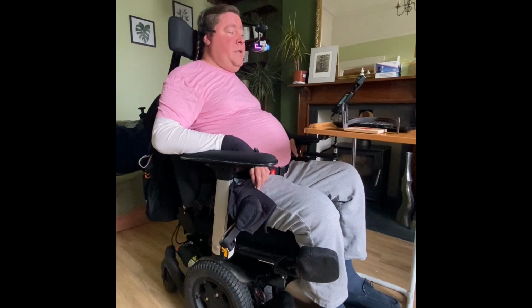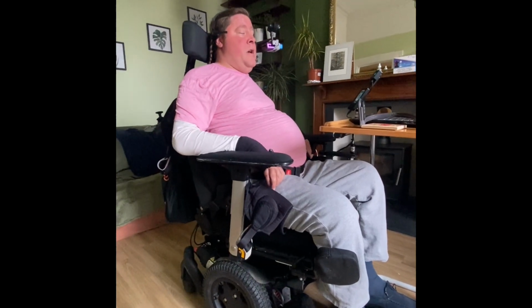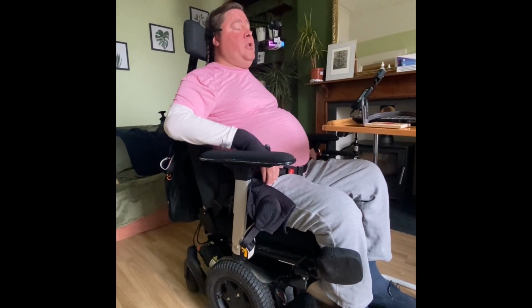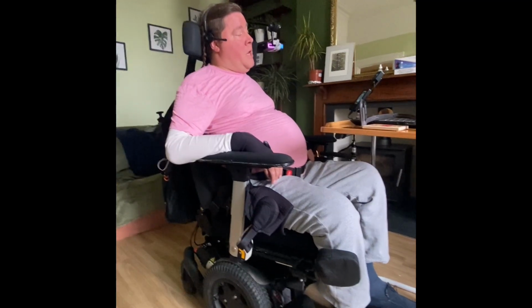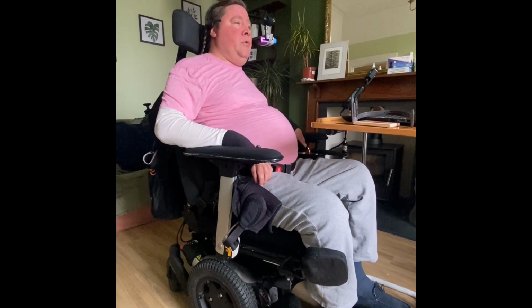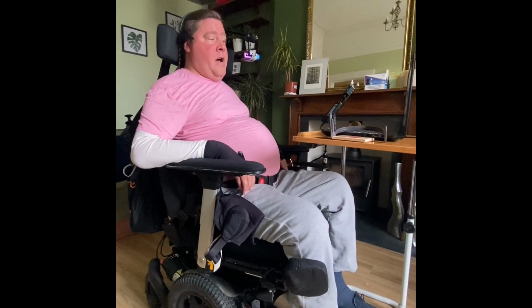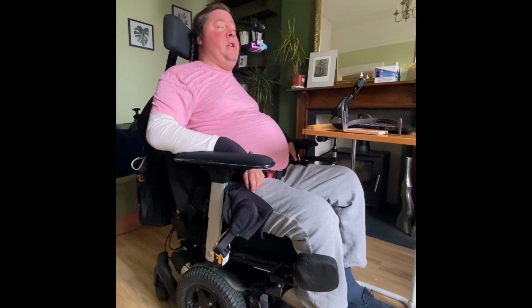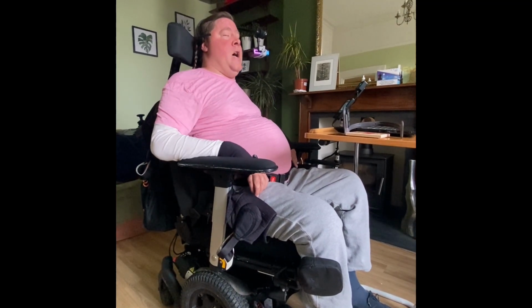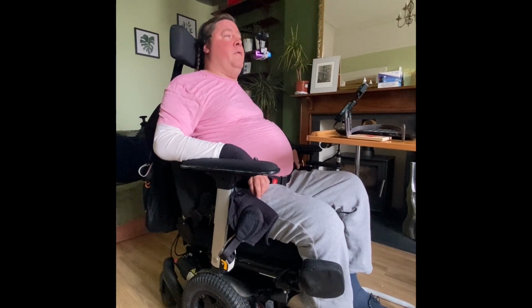The second part of this is a bridge which allows that graphical user interface and the inputs that are given by the quadriplegic user, to translate into actual hardware manipulation of motors and various sensors, allowing the quadriplegic to drive using either head movements or voice control. Finally, I have done a simulation in Unity of a flying wheelchair algorithm that would allow a quadriplegic to fly through a 3D space using only head movements or voice commands.